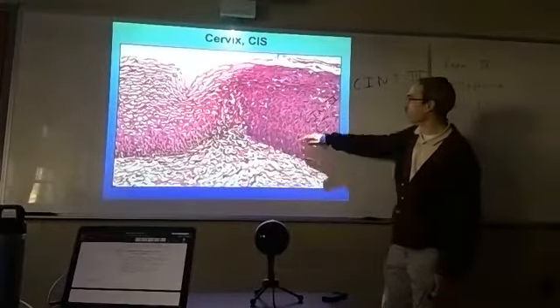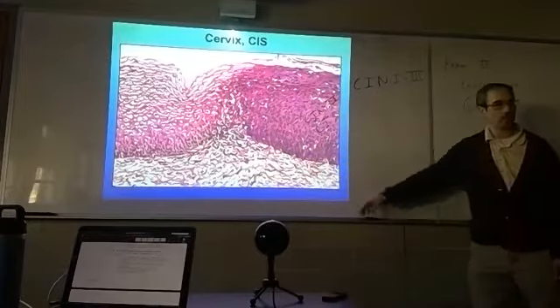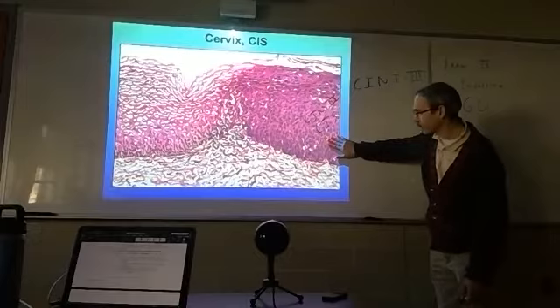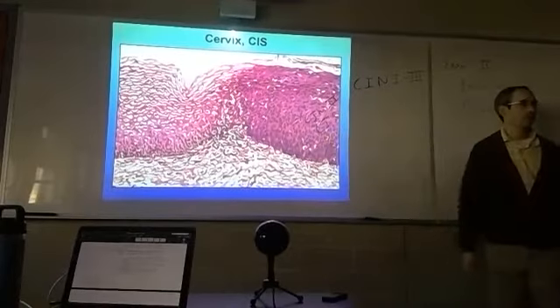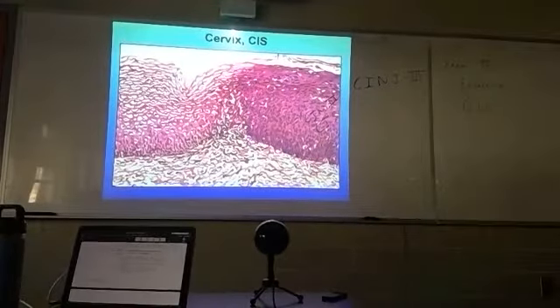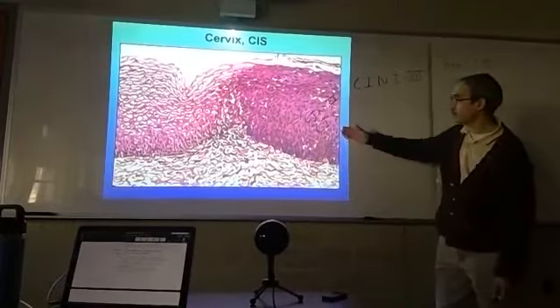These cells are all confined to the epithelium by a natural tissue barrier, the basement membrane. As a result, there's no evidence of local invasion, and therefore you cannot call this cancer. You can only call this dysplasia. Dysplasia by definition is a benign lesion. Now, there are a few things that we can do here. Okay?